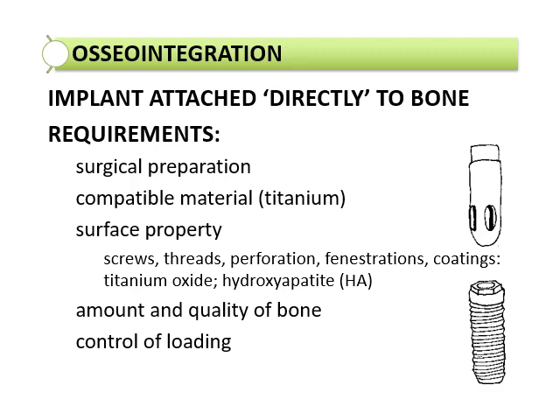When it talks about loading, loading refers to the placement of the restoration. The faster the bone regrows, the faster the loading time. So I know today on TV you'll hear a lot of commercials about same-day implants. Yeah, they do that. That means that they put the implant in and they load them the same day. But it all just depends on the individual patient and the situation going on in the individual mouth.